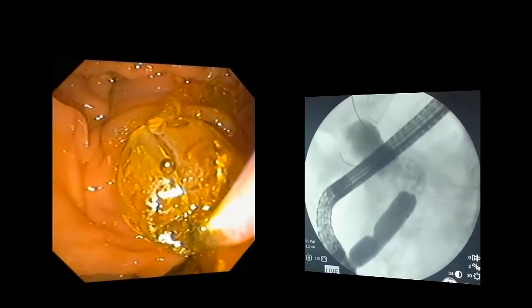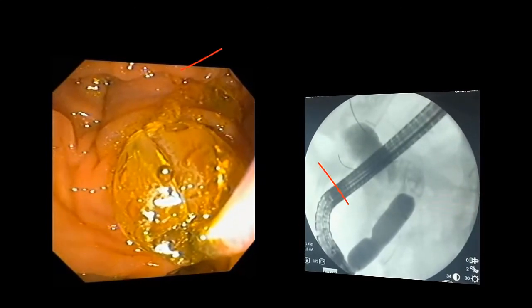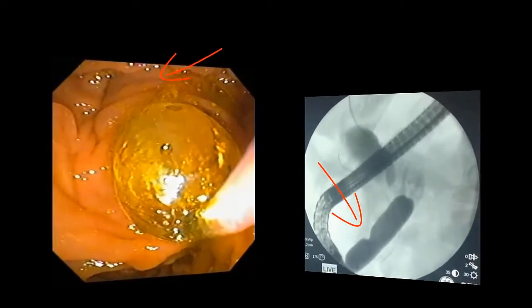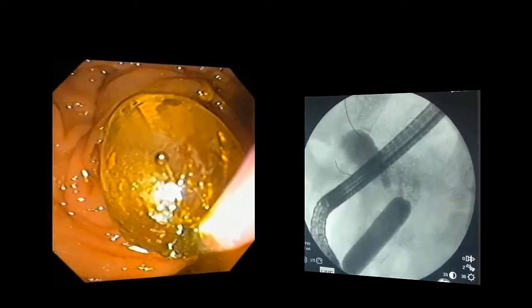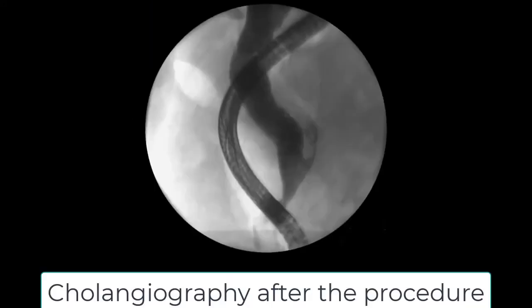Coming back to Case 1, the dilation until the disruption of the radiological waist can be observed in the red arrow. After the papillary large balloon dilation, all the stones were removed, including some large stones as shown in this video. The picture here shows all biliary stones in the duodenum, with the cholangiogram confirming the success of the procedure.